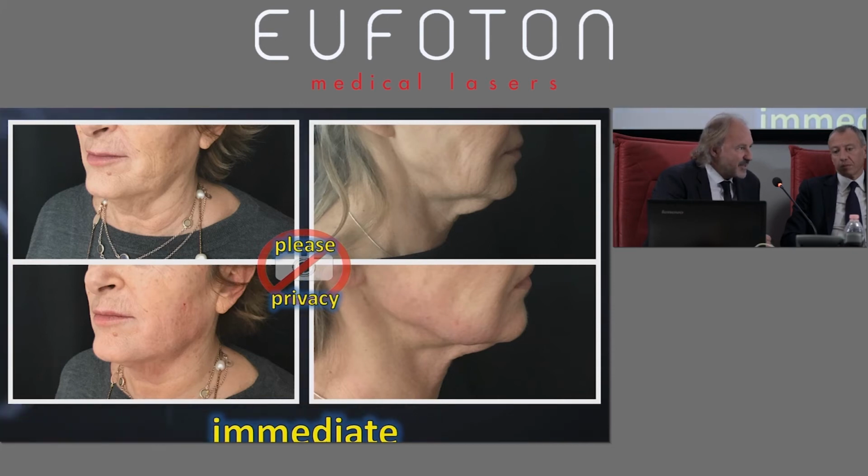I try not to do the filler before, because if I want to go also in the third inferior area for some refinement, I'm going to spoil it. So traction threads. So we speak of these traction threads.